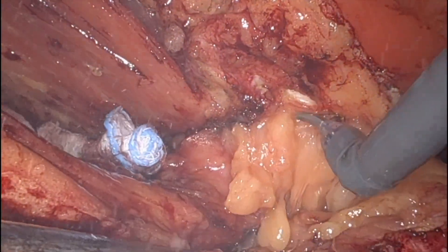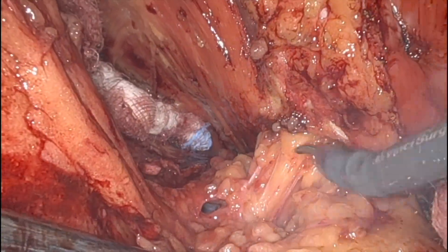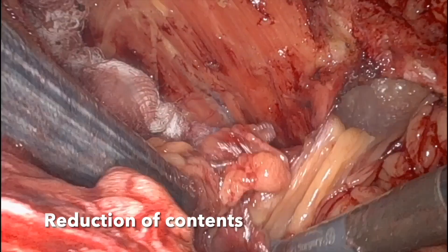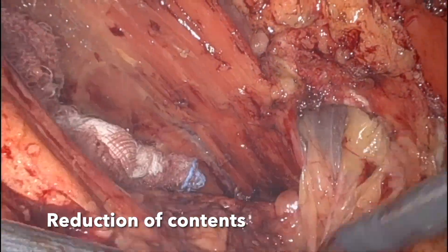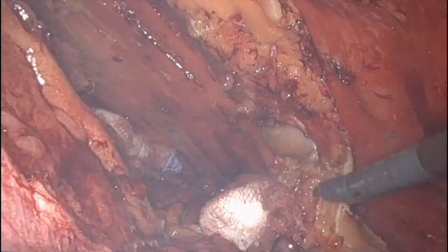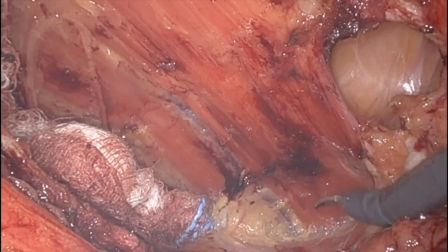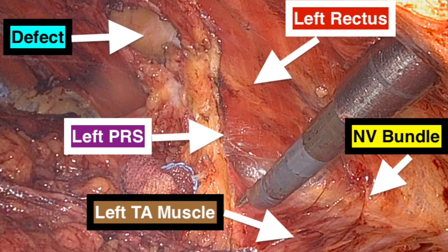The contents of the sub-xiphoid hernia were reduced meticulously, and hemostasis was maintained. After the reduction of content, you can appreciate the anatomy here — the instruments used were a fenestrated bipolar and a scissor, and the direction of the camera, scissors, and bipolar fenestrated grasper are noted.